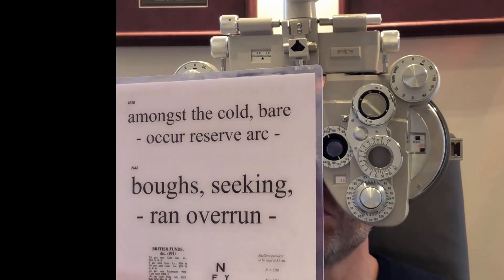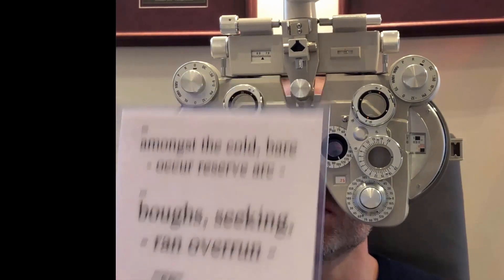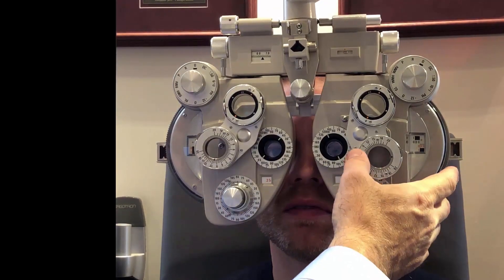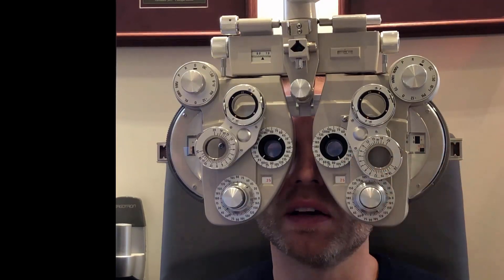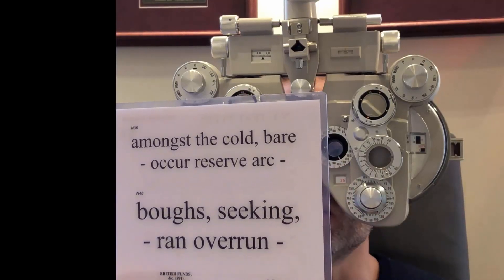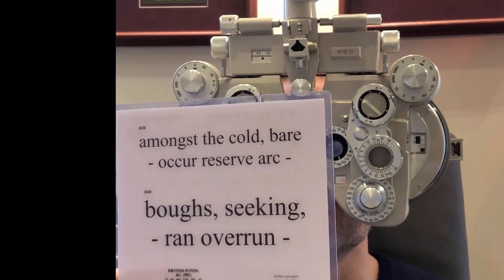How far up can you see there? Printing at the top one — printing of this size is used only for special applications. Look at the top there — is there still any ghosting? A little bit, but almost nothing. Almost nothing? So is it the same here? I think that's gone now. Gone completely? Yes. And how far up can you see here? I can still see the top one. Printing of this size is used only for special applications.